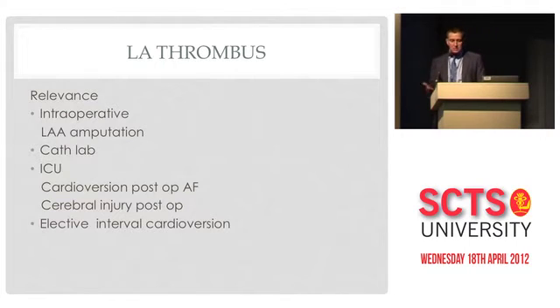So we need to think about left atrial appendage thrombus. I think if we put someone to sleep for a cardioversion procedure and they were to have a stroke, we will be implicated in the cause of that, and any case that may arise from putting that patient to sleep if they had an embolus.